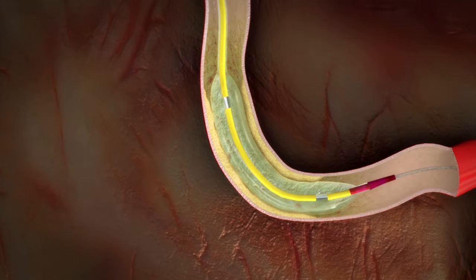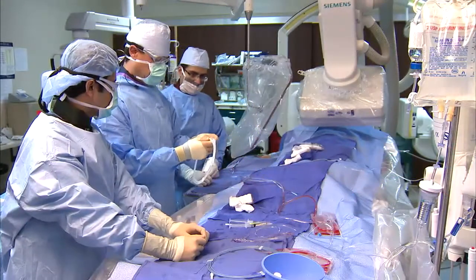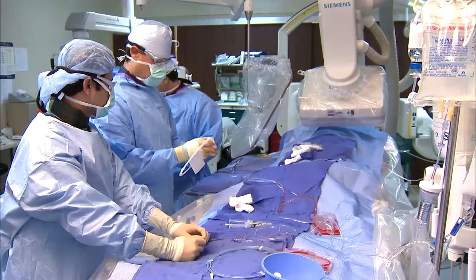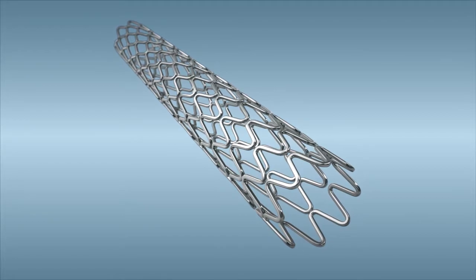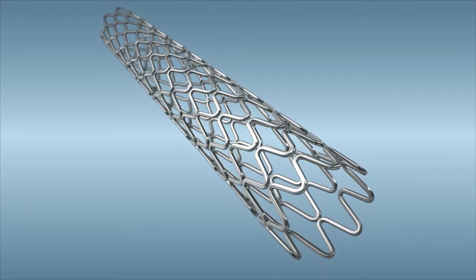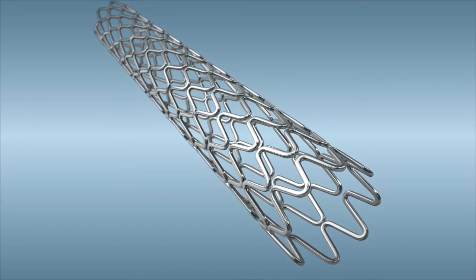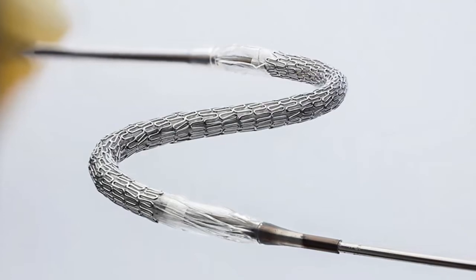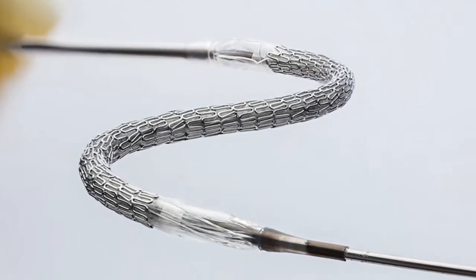In some cases, balloon angioplasty alone may not effectively open your blocked artery, and your doctor may recommend placing a coronary stent at the site of the blockage. A stent is a tiny, expandable, wire mesh-like tube that acts like scaffolding to support the artery and help keep it open. The unexpanded stent is mounted on a deflated balloon catheter.